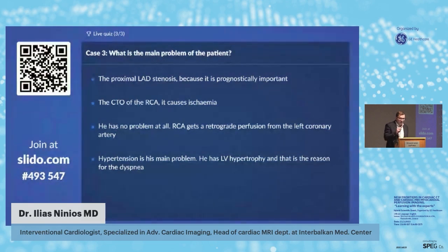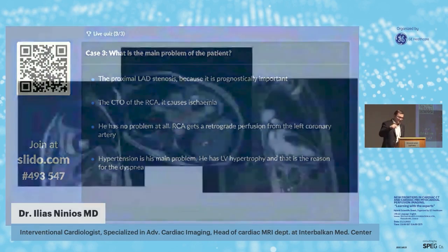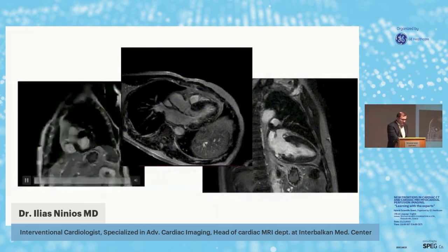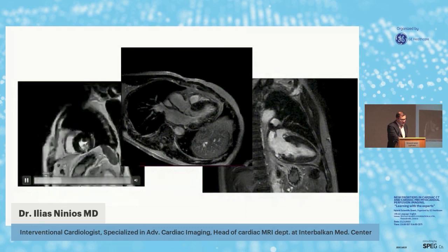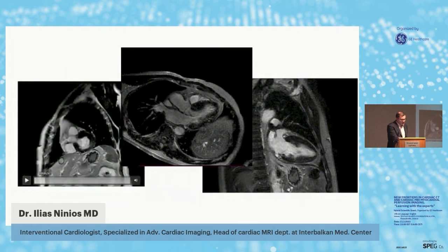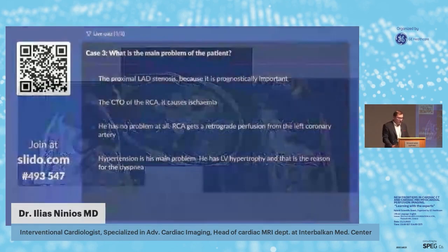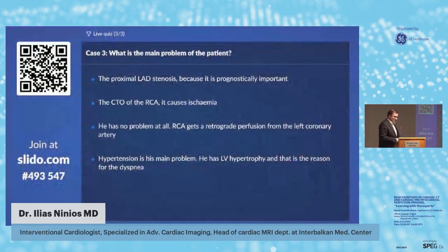Yes. We compare also the late enhancement images. We see there is no scar or just a little subendocardial scar. And now the questions. What is the main problem of the patient?